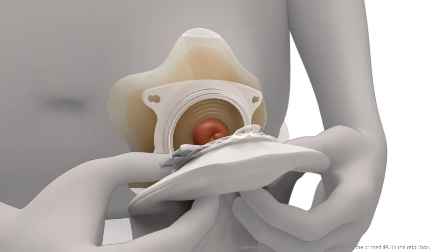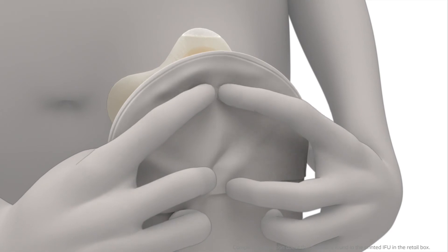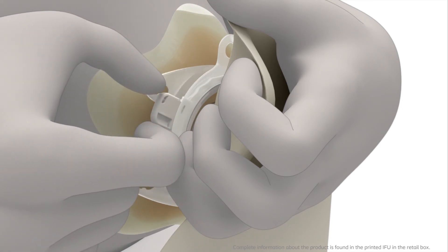Connect the bag and the base plate together from the bottom with your middle fingers. Scroll your index fingers upwards and apply gentle pressure to the top of the coupling until you see the bag is securely fastened to the base plate. Close the lock ring by pressing the lock together. The bag is securely attached to the base plate when you hear a click.